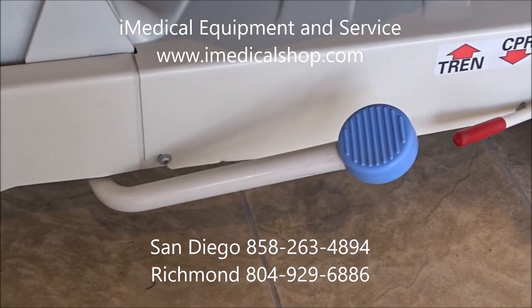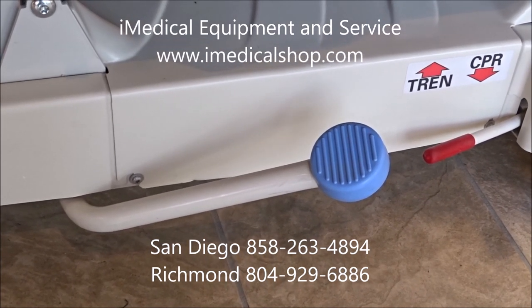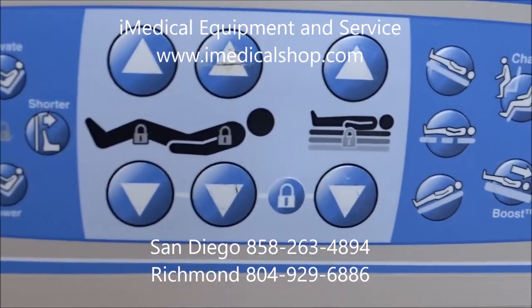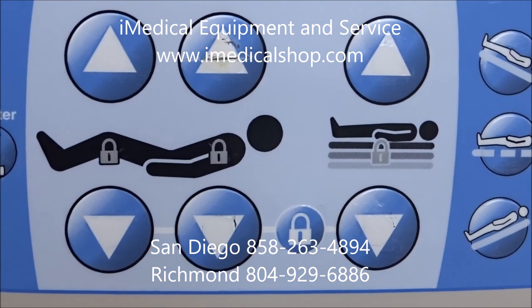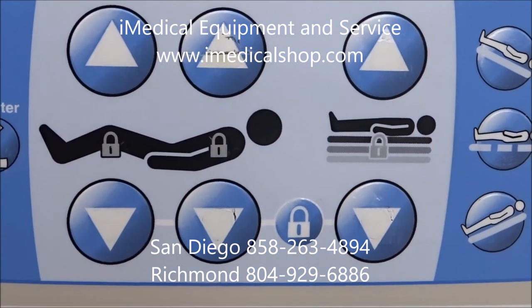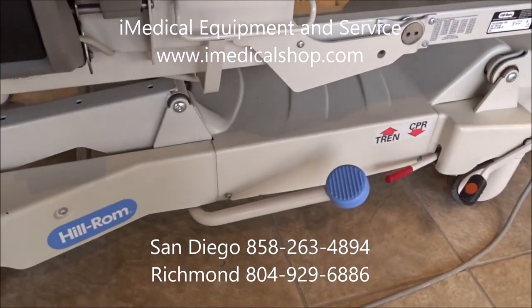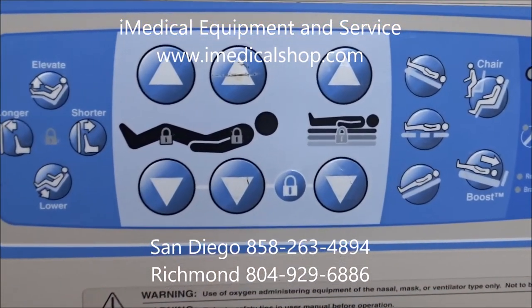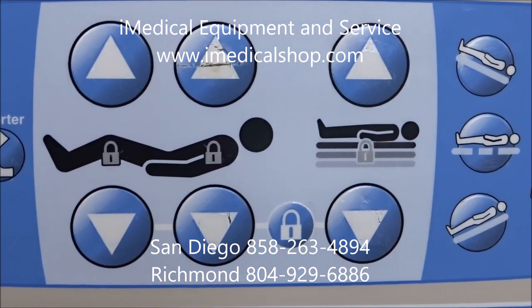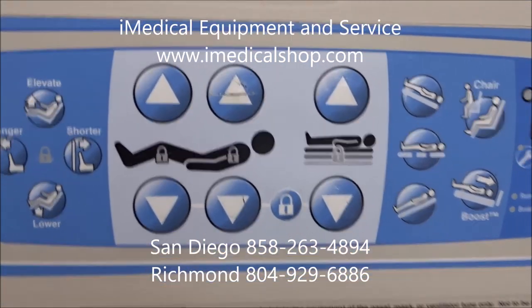This kick pedal — if you push it up and down, it's a hydraulic piece that operates the bed if you ever lose power. It works only for basic features, so you can get somebody flattened out or out of a chair position. If you use this kick pump in an emergency, you can still use the control buttons with a good battery backup system.